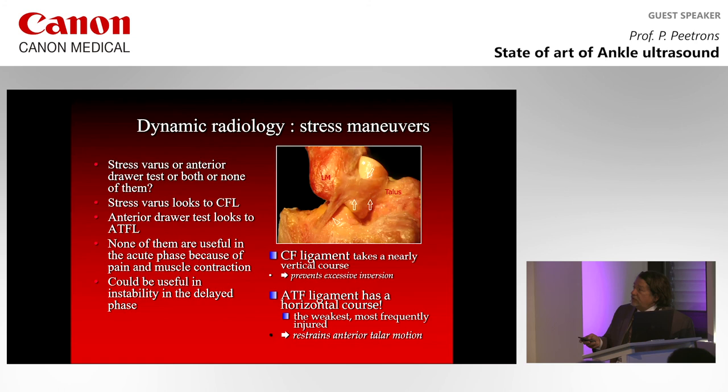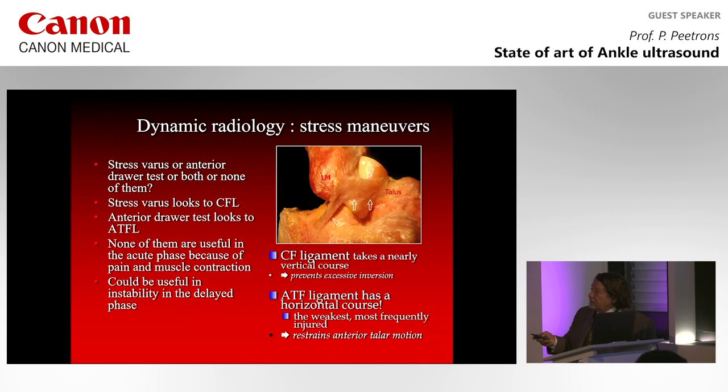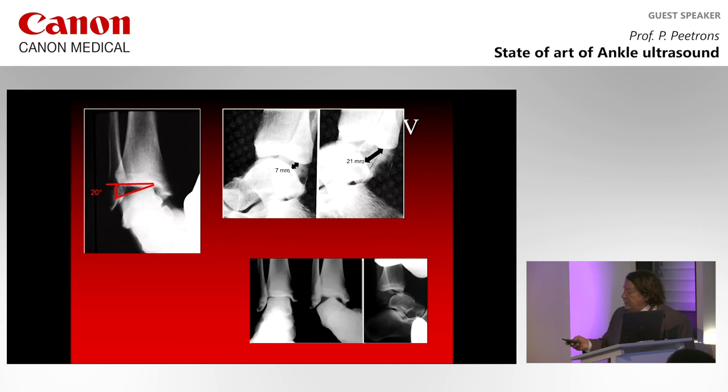So the anterior drawer test is very used in radiology, but we can do it also with ultrasound. Don't forget that the ATFL has a horizontal course like this, coming from the fibula and going to the talus. So when we do the anterior drawer test, we will see movements between the talus and the fibula. This is how we do this image in radiography, of course, or this one. You can see that the talus is going forward towards the fibula and the tibia, of course, but we are looking in ultrasound at the fibula.